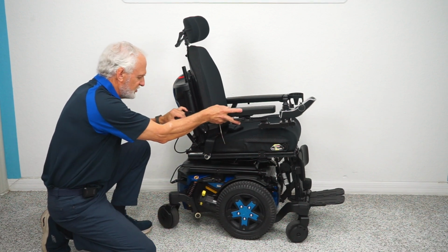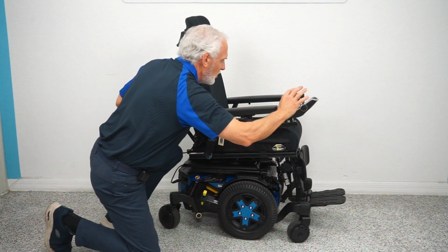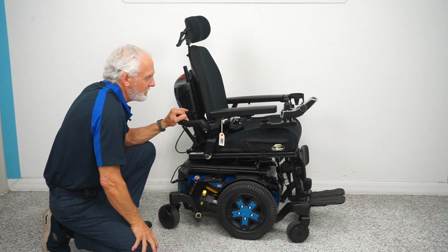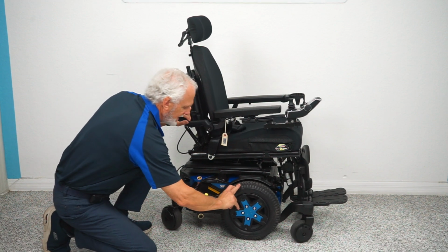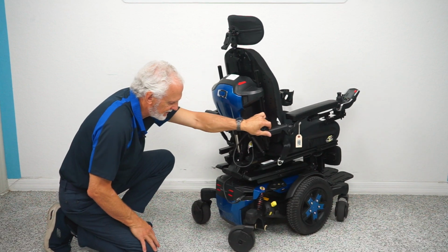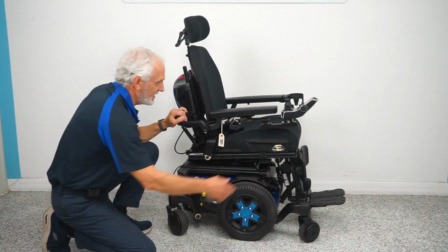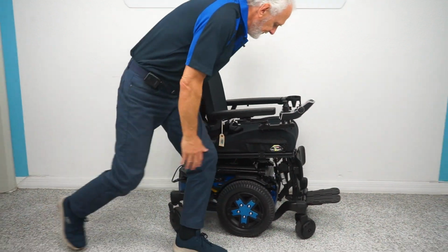If I want to push this chair, you can see it's in gear, it's not going anywhere. But if you turn the power off, and the reason you want the power off is these are electric motors, so you want the power off. And then you can take that yellow lever, push it down, and now look, you're in neutral. See that? See how easy that is? When you're done, put it back in gear, turn your power back on, and you're ready to go again.